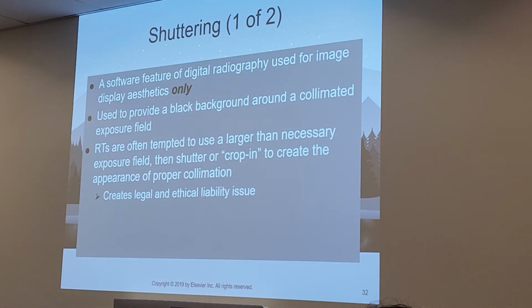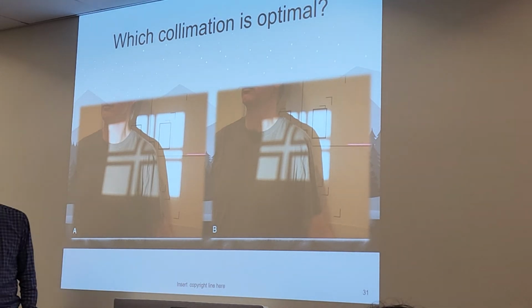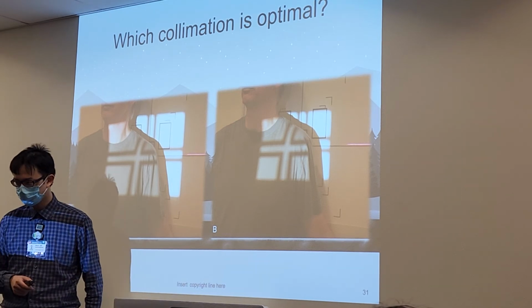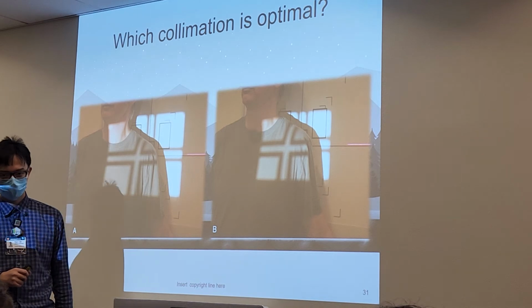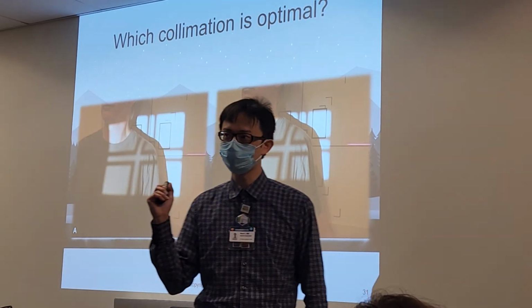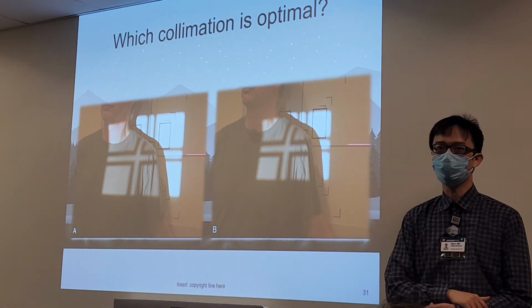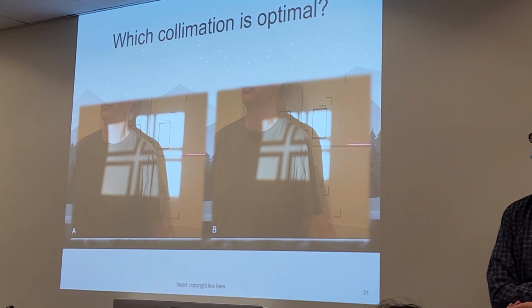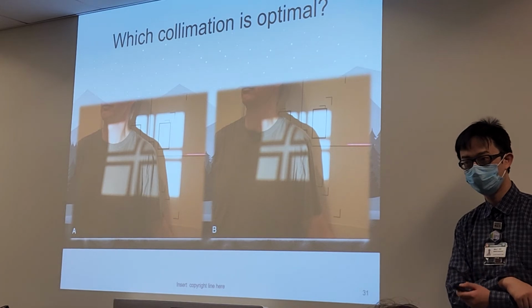For that picture, are they identifying the area of the clavicle, specifically the head in the shoulder area, or just the humerus? Are you able to tell that based off the area they're getting an image for? Good question. When you learn these procedures, you will learn that each one is looking for specific anatomy. In order to show that anatomy, each one must be centered to a specific location.